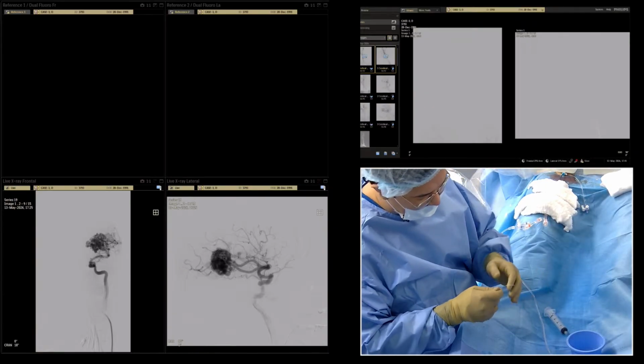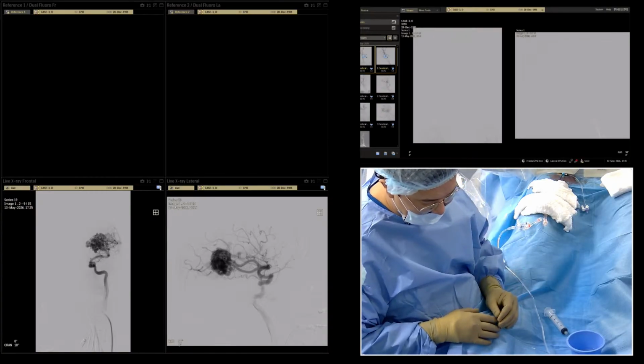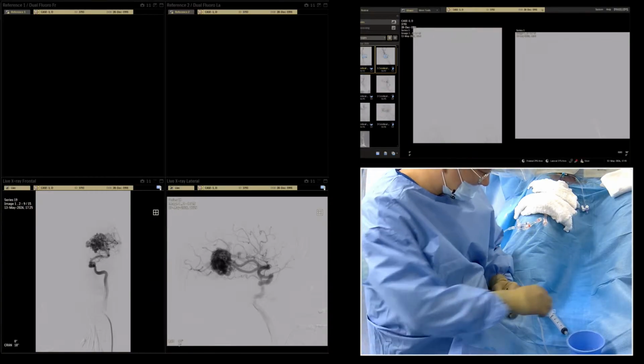Now we have on the shelf only 25 Sonic, 25.